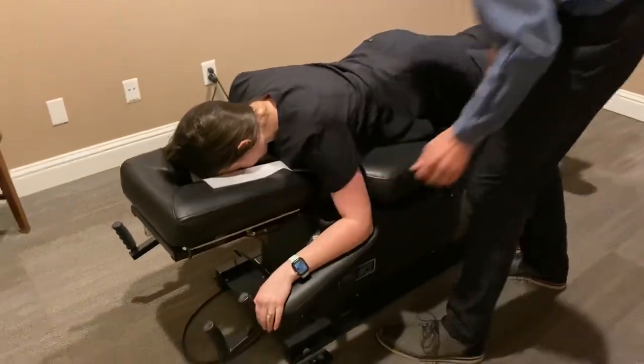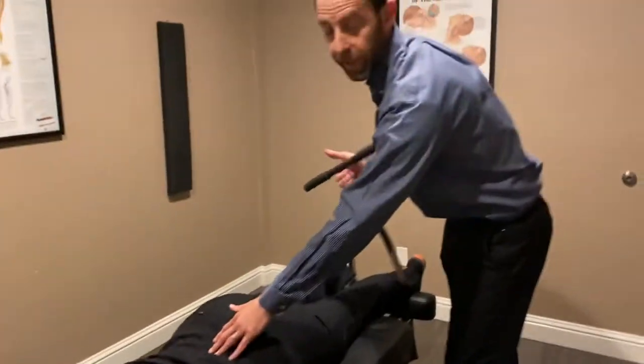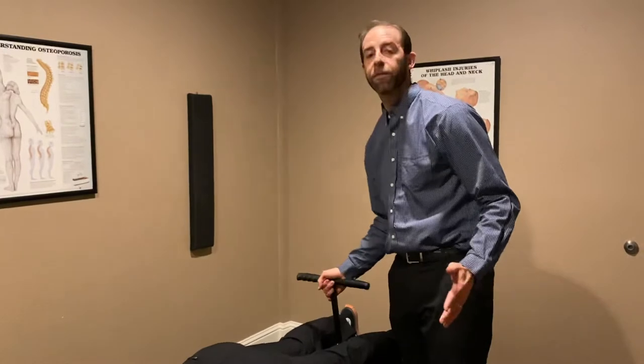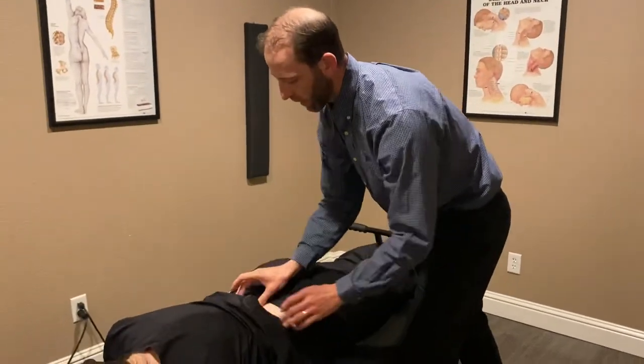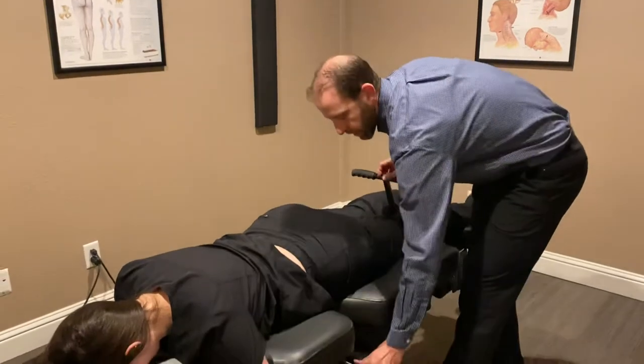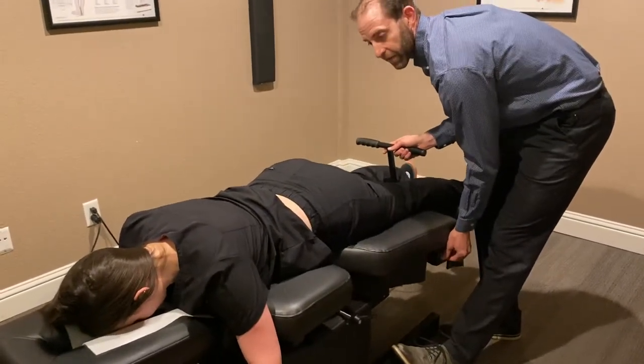The table is really great for people with lower back pain, especially facet pain — we tend to call that arthritis — and it gently allows us to open that area of the spine up. We turn the table on and we can modify how fast or slow it goes.